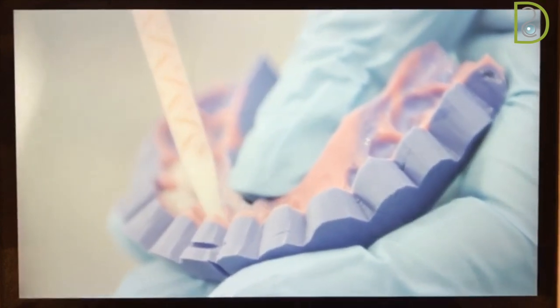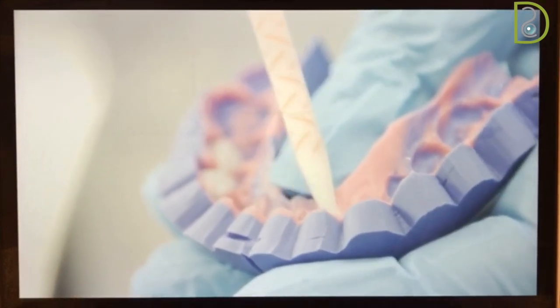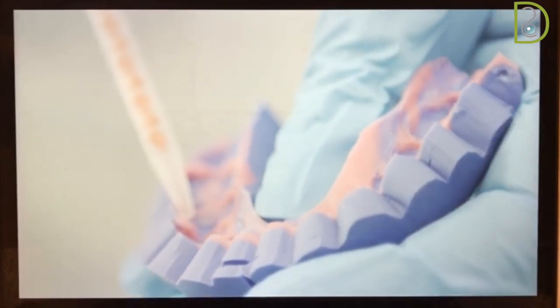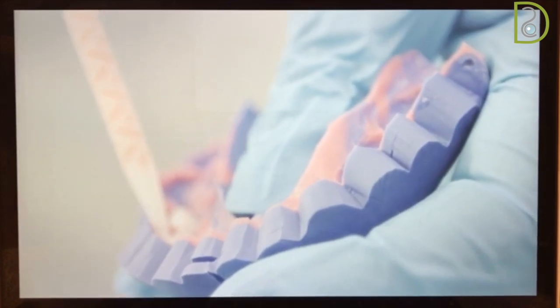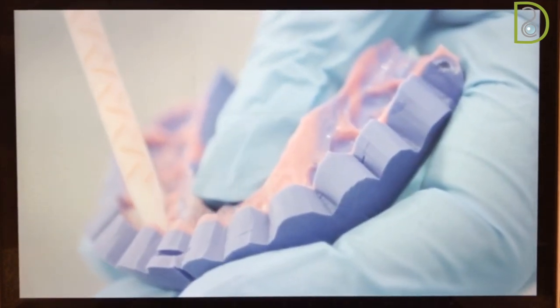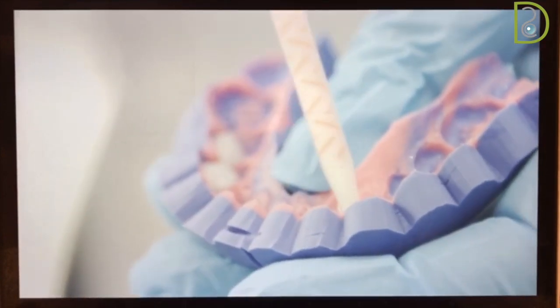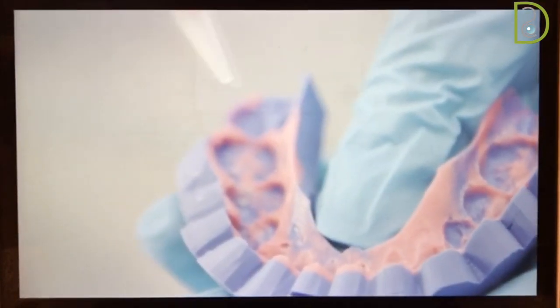In addition, it tells us how much preparation we need, especially when we want to lengthen the teeth or bring them, for example, facially. Now, for teeth that are lingually tipped, you might end up with 0.2, 0.3 millimeter preparation, and that's all you need in your final restoration. You don't need to remove more than that.